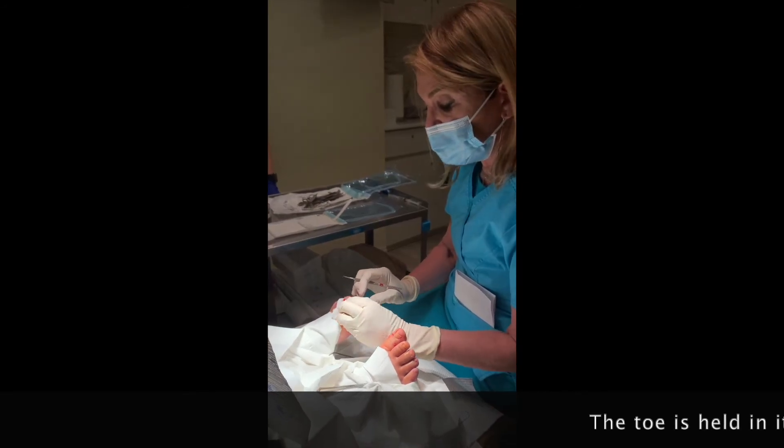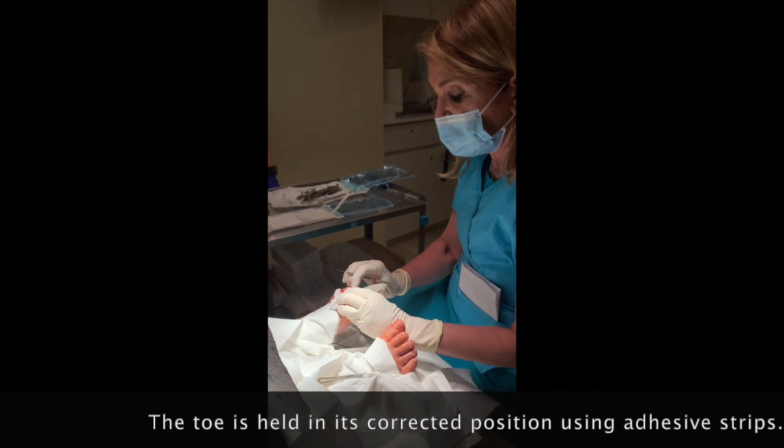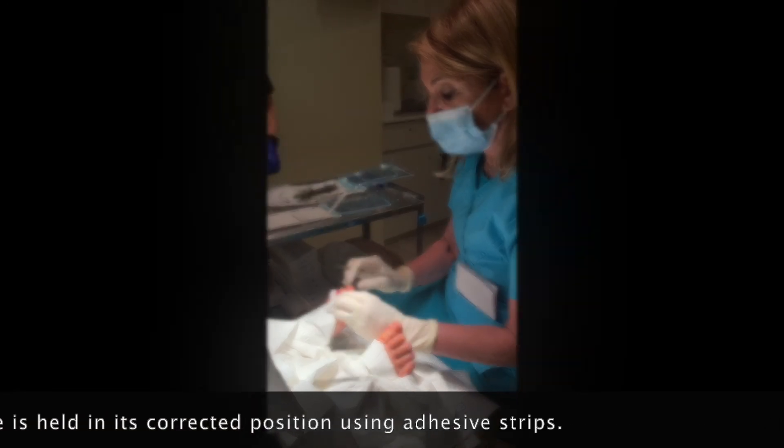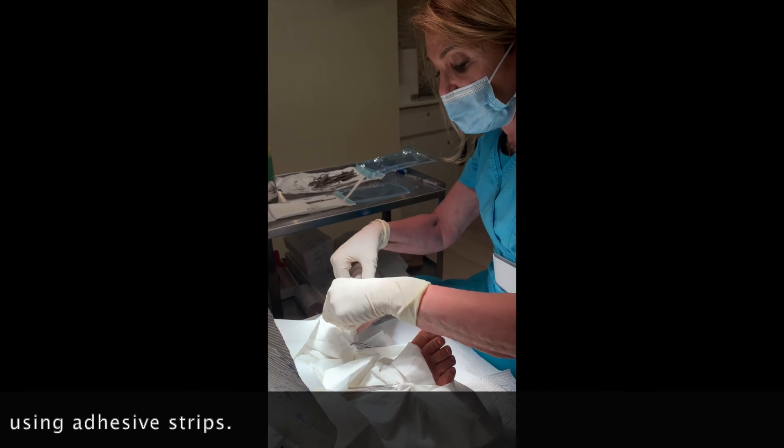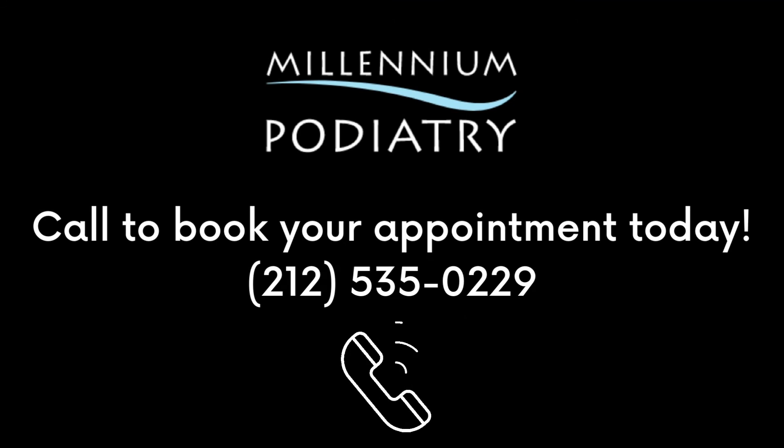Now what we're going to do is actually put the toe in a corrected position using Steri-Strips — it's just a little adhesive that goes on the toe. And as you can see, the toe is perfectly straight now. Thank you.